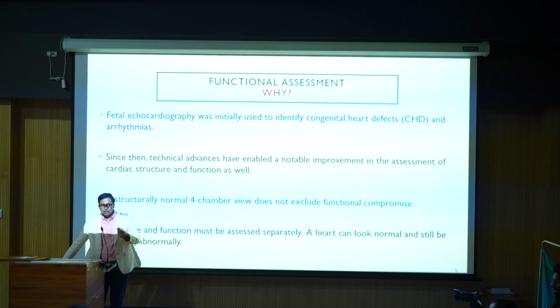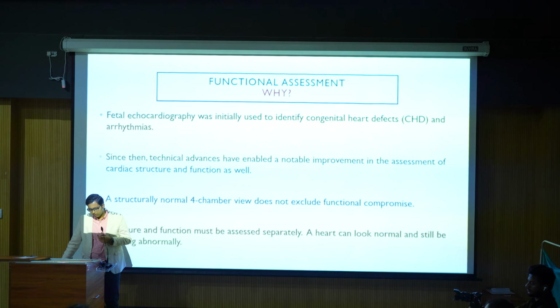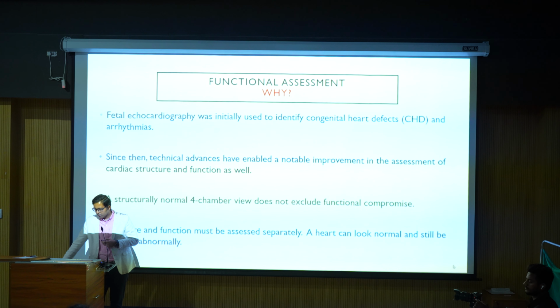Because initially, in early stages, the fetal echo was basically used to identify the congenital heart diseases and the arrhythmias. But over so many years, a lot of technical advances have enabled a notable improvement in the assessment of cardiac structure as well as function.